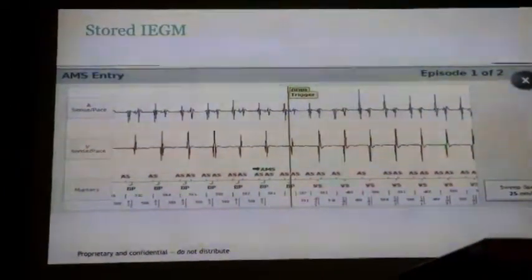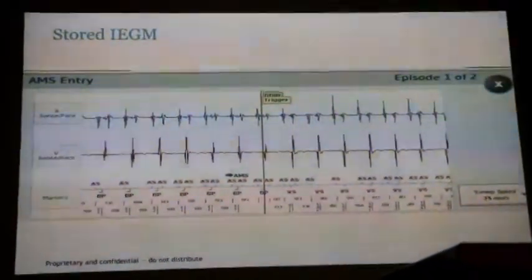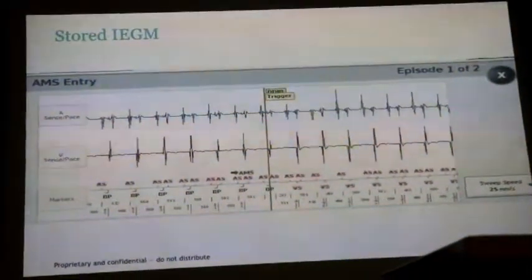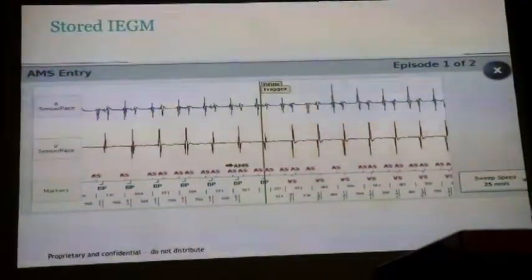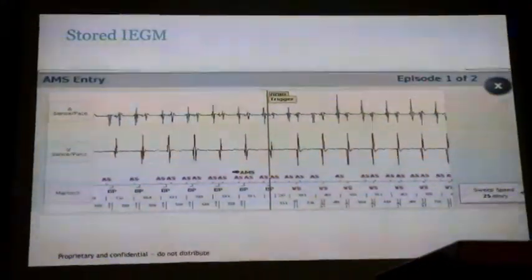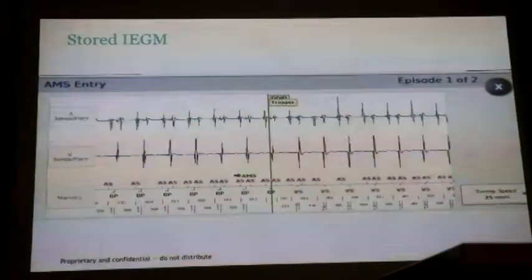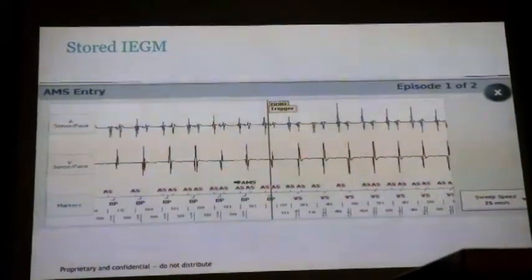If you're giving incorrect information about the atrial rate into that algorithm, there is a potential, not on the way we program today, but on older devices, there still is, depending on your program, for wrong information to go down wrong channels in SVT discrimination. So a far-field R wave can cause loss of CRT, decompensation potentially, and inappropriate shocks. Just this little thing here.